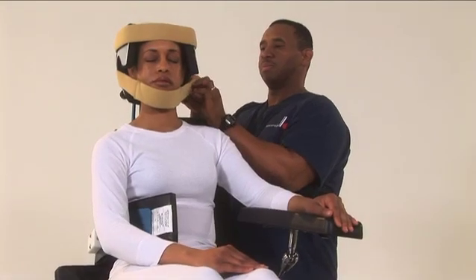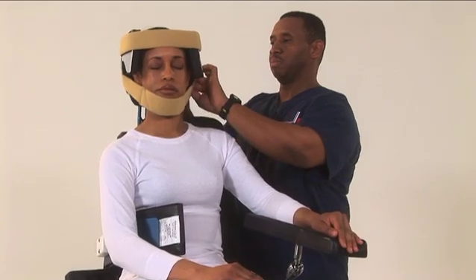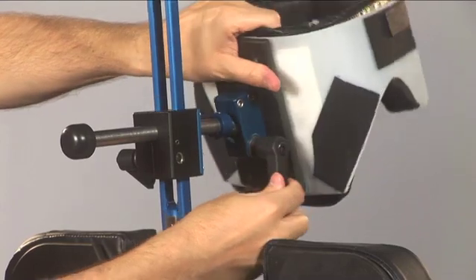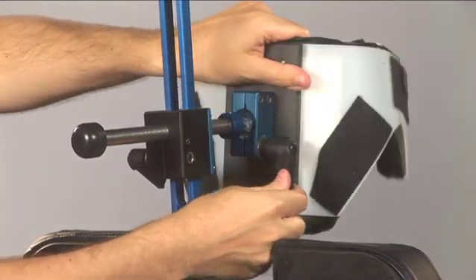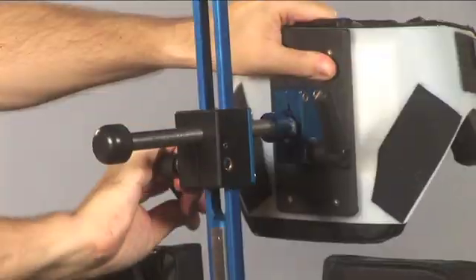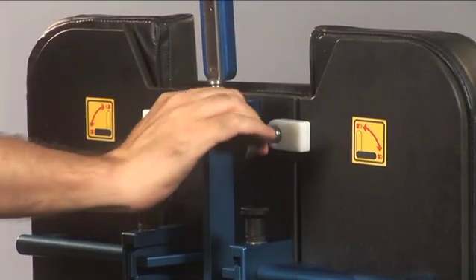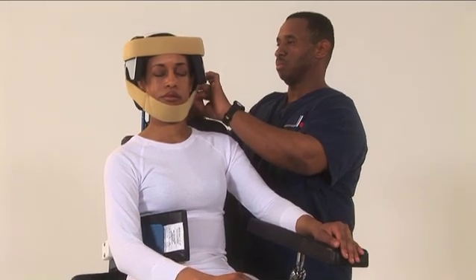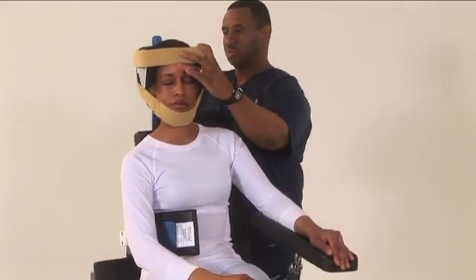Note that the head and chin straps are designed for single use only. Once anesthesia is administered, strap the patient's forehead and chin to the head section. Loosen the top ball joint behind the patient's head. Position the patient's head to the required position and then lock all three knobs. Note that it is important to secure the chin strap prior to the procedure so the patient does not slip down in the chair during surgery.